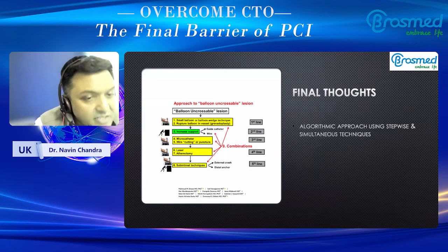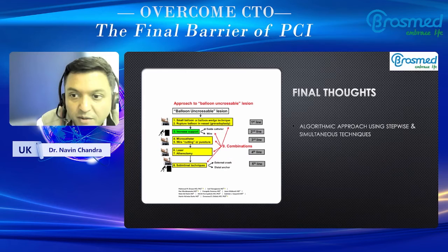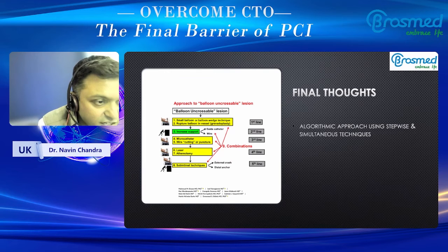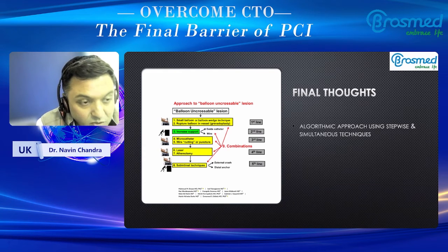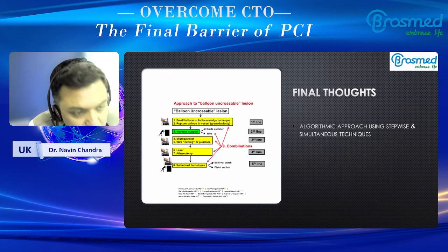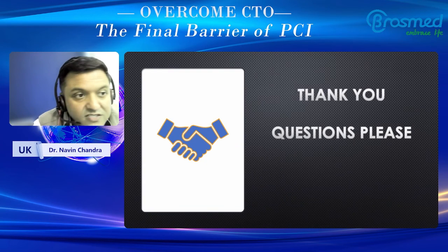My final thoughts are, referring back to that algorithm published by El Reyes and colleagues, that there are options available to you. I think it's important to strategize upfront of your procedure by combining a lot of these techniques, with extra support from the outset, increasing your support during the case, and using techniques to allow balloon crossing. And then once that has happened, you may need to upscale to atherectomy techniques like rotablation or laser, or using things like Shockwave if it's deliverable, prior to getting into your final result. I hope those cases were interesting for you as the audience.